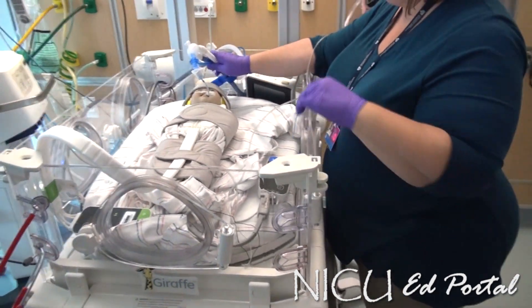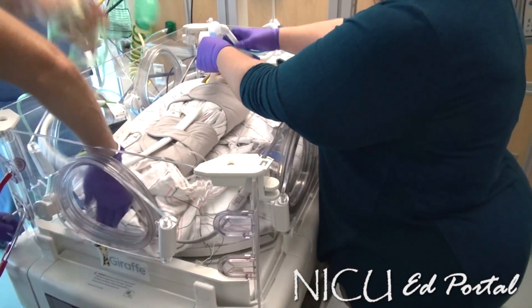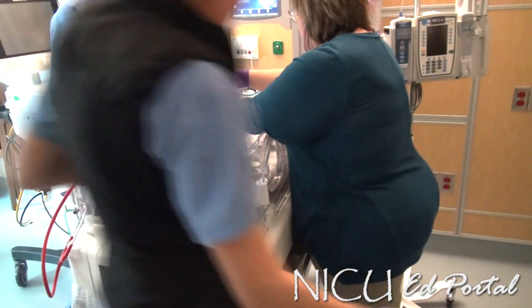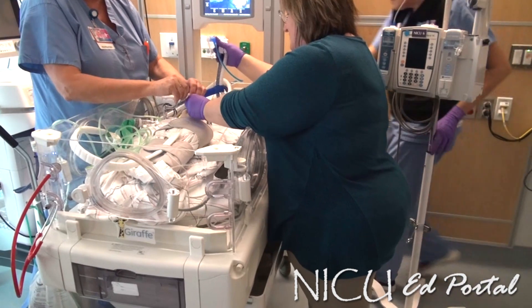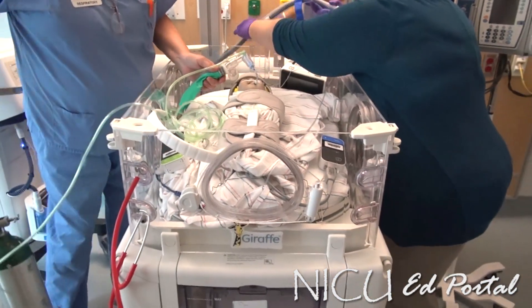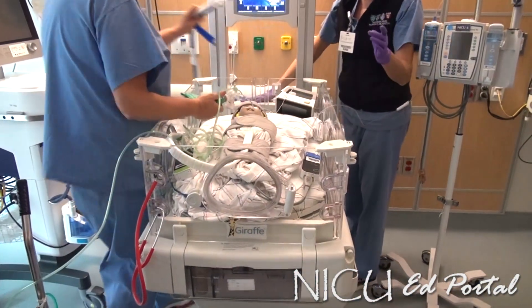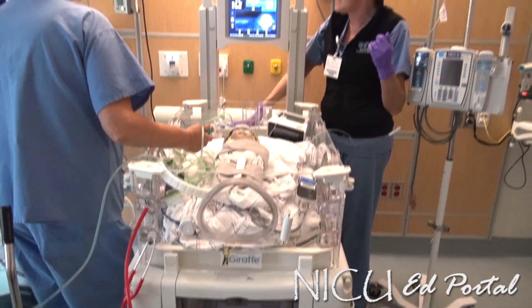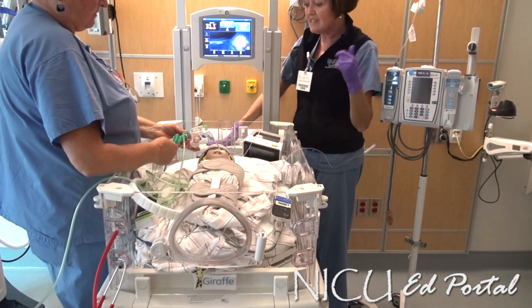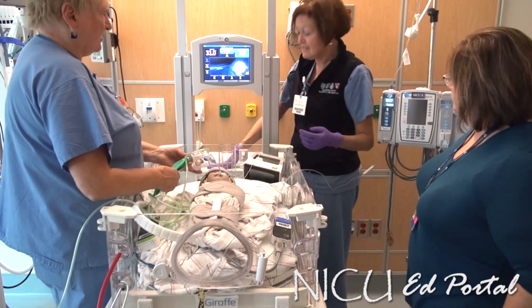We're ready to transport. Taking him off the vent and moving him over. You guys tell me when we're nearly set to go because we're going to have to turn the bed off for the duration. He's been on the warmer so the bed is still nice and warm and he's wrapped up well. The MRI team called to ask what temperature his bed was at — he's currently in a 31-degree bed and they've set the MRI suite to 31 degrees, which is great because when he goes in it will match his current temperature.